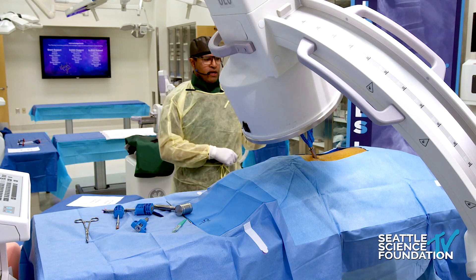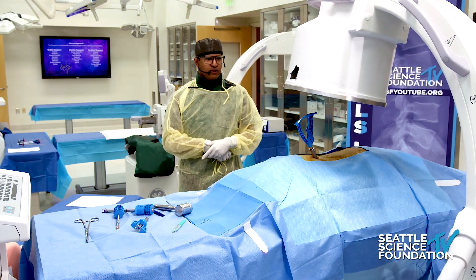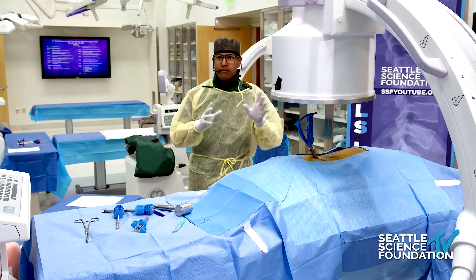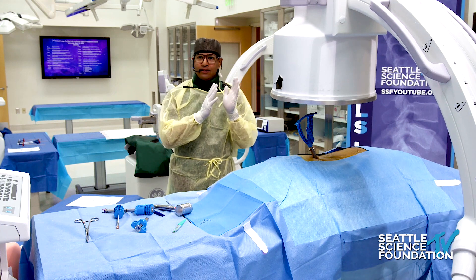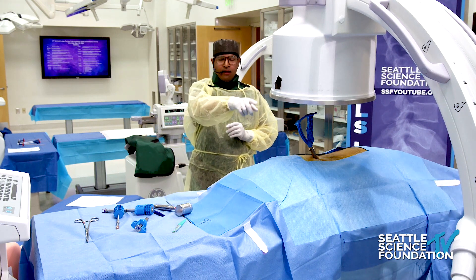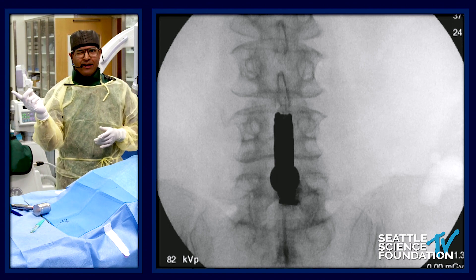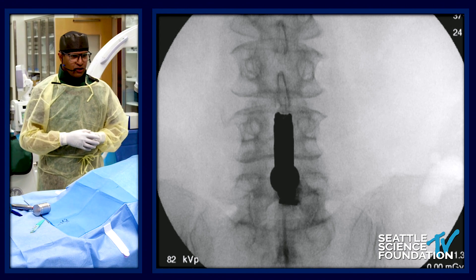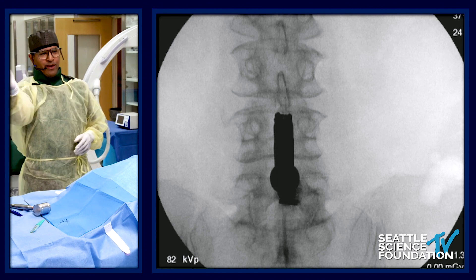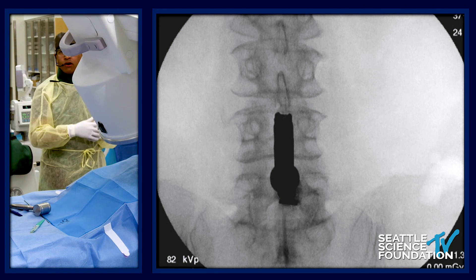For your fluorotech: all you have to do is be 15 degrees more cranial with the image intensifier, then 15 degrees caudal. You can see the two nubs of the gauge are now straddling that L3 spinous process. We'll check the caudal view as well. You can see the left nub — the right nub is hidden by the handle radio-opacity — but that looks great.